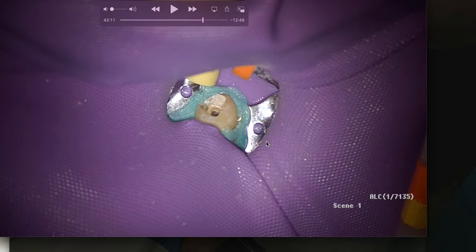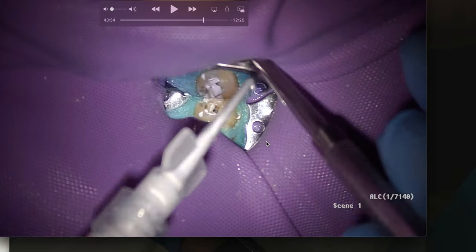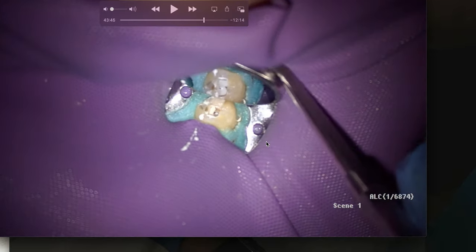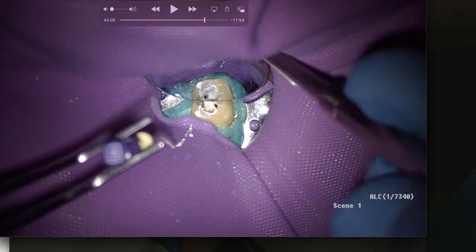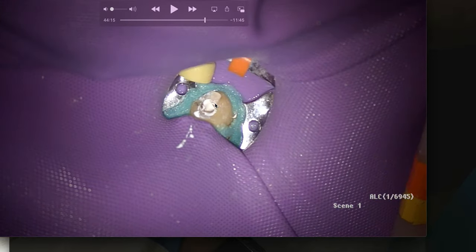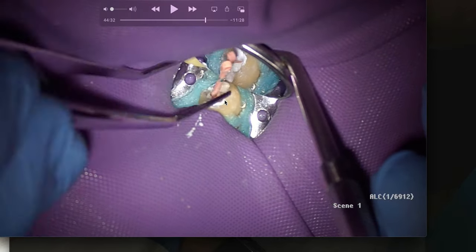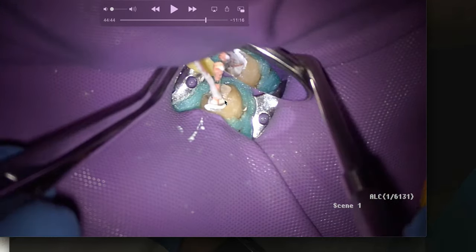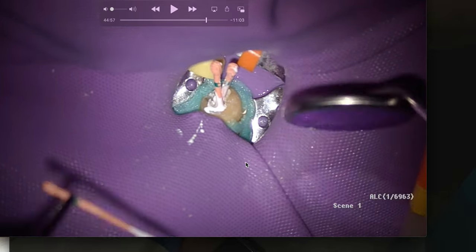Same thing for the other canals at 18 millimeters. Now we place our BC sealer. I'm going to take a size 10 file, run it to length — I find there's an air bubble underneath the BC sealer, and if I don't pop that air bubble the gutta-percha point sometimes doesn't go all the way to length. So we break that air bubble, coat the walls as best we can, and take our gutta-percha points — sometimes I coat them with sealer, sometimes not — and give a little pump. I've cut the mesial point shorter because I know those canals join. Place the distal — boom.